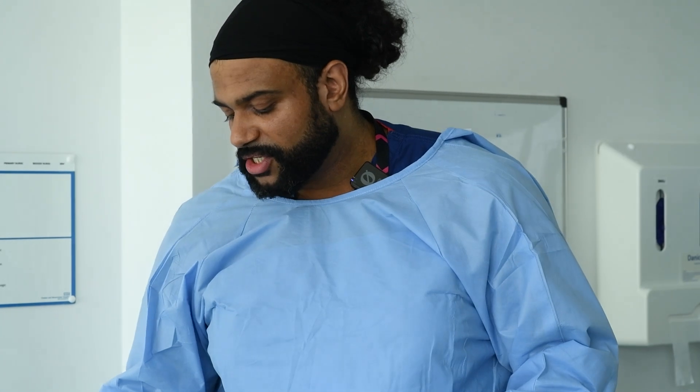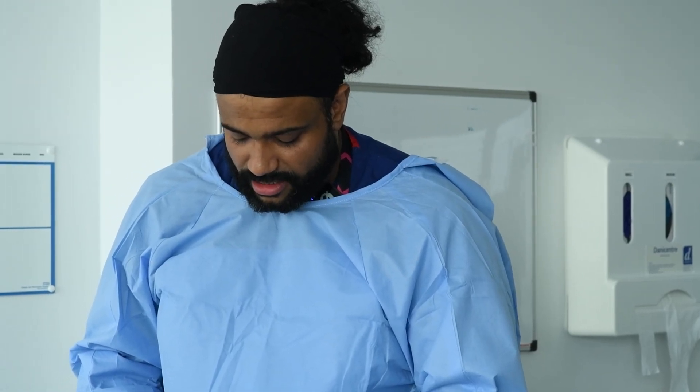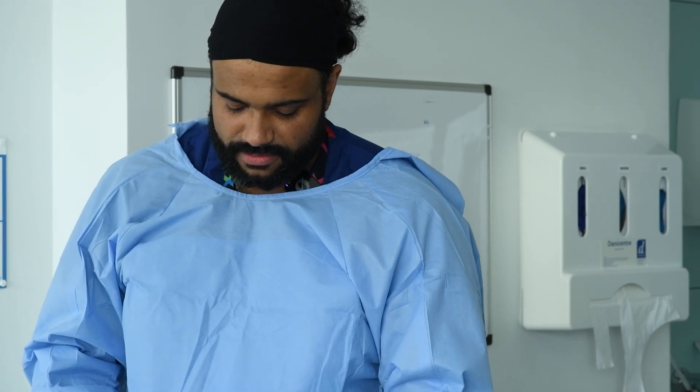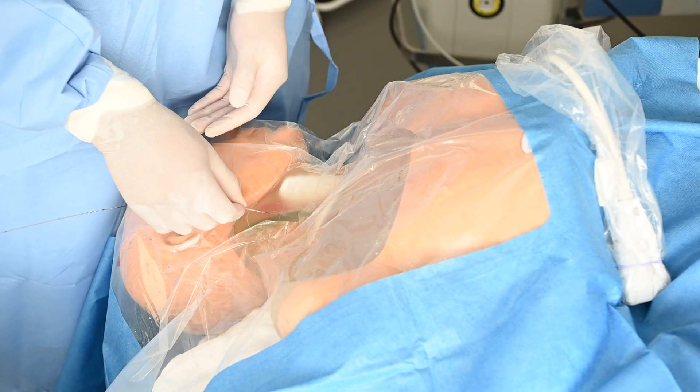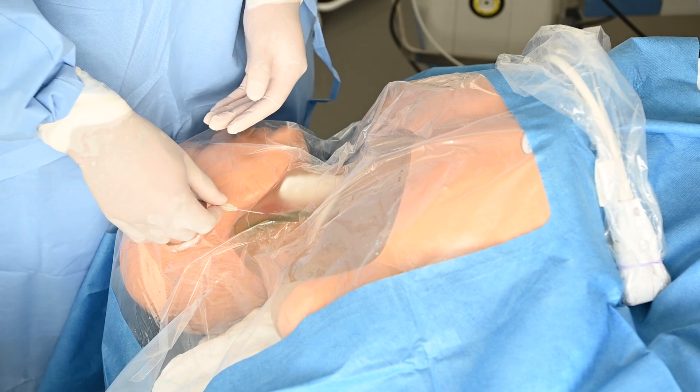In those situations, to troubleshoot, instead of taking it all out, repuncturing, or opening another set, you can just take the cannula off the needle it comes with and advance that cannula sheath over the guide wire so it's now inserting into your vessel.